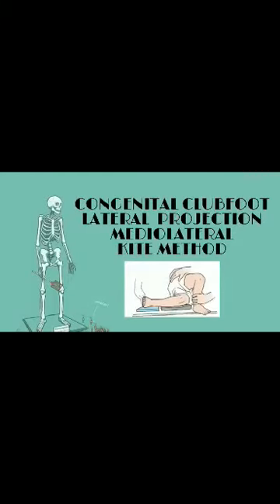Congenital clubfoot lateral projection, mediolateral, Kite method. The Kite method lateral radiograph shows the anterior talar subluxation and the degree of plantar flexion, or the equinus.